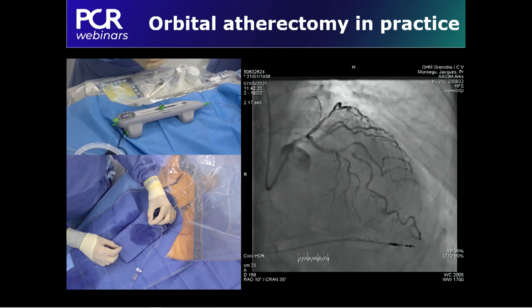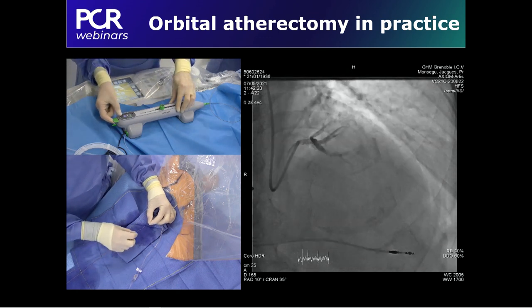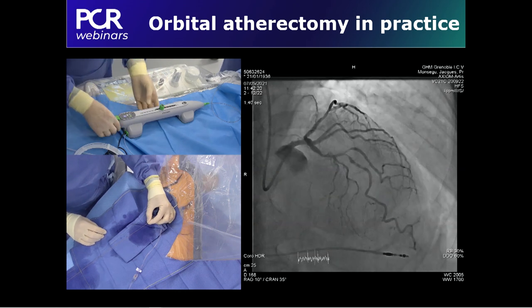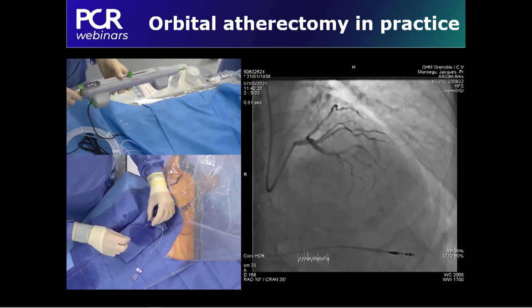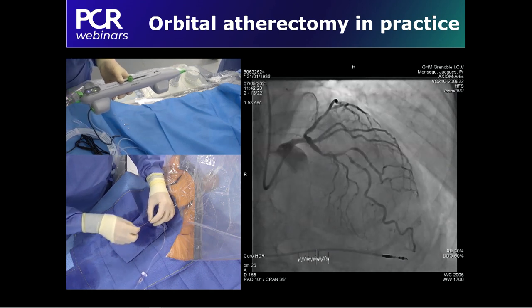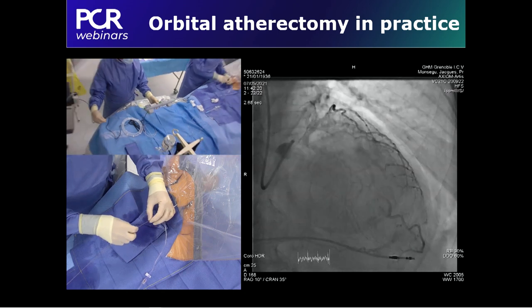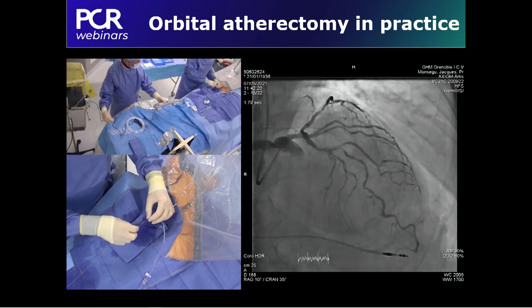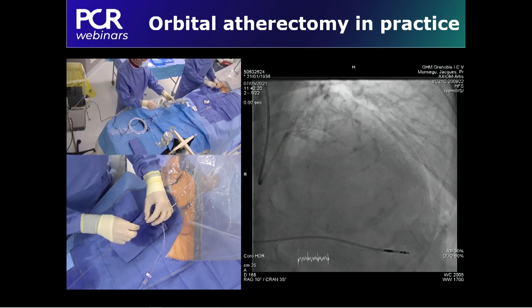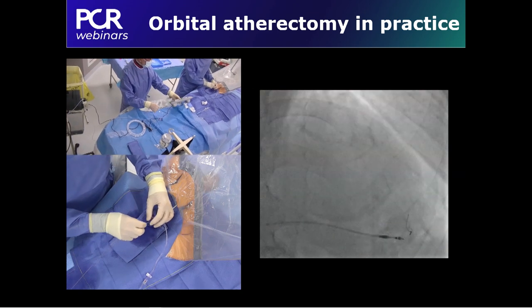So it works very well. So we can advance the system. I pull back the brake, and Benjamin, you can advance the crown. You have to keep the device as straight as possible to limit the friction. You see, we feel confident with the wire. Just a small scopy.